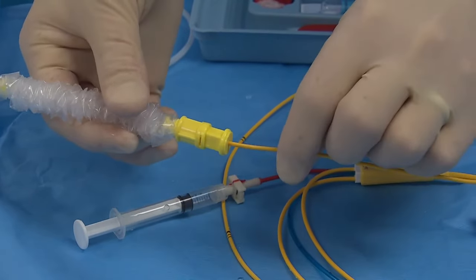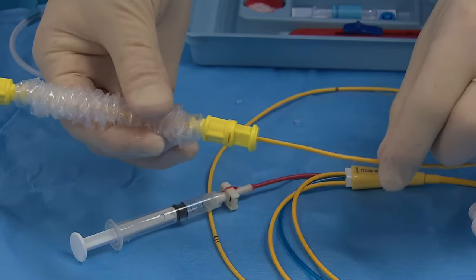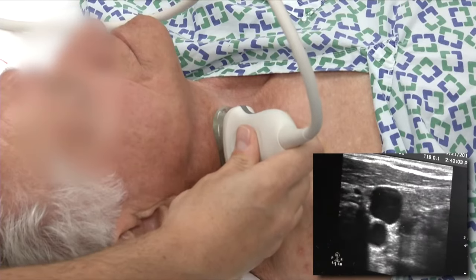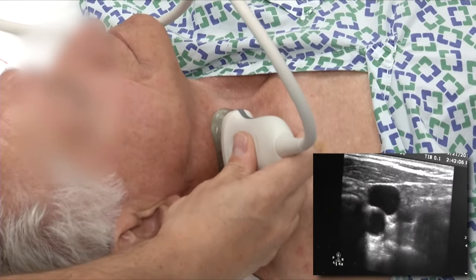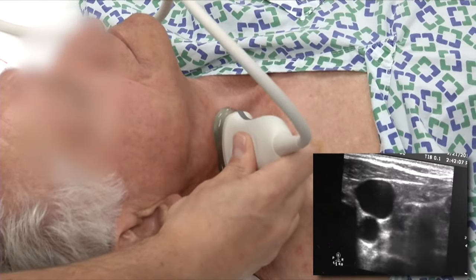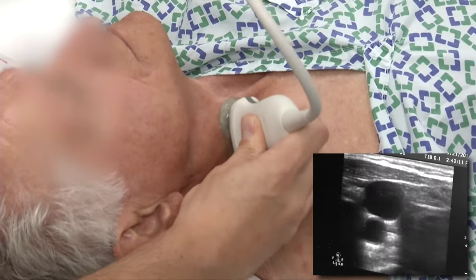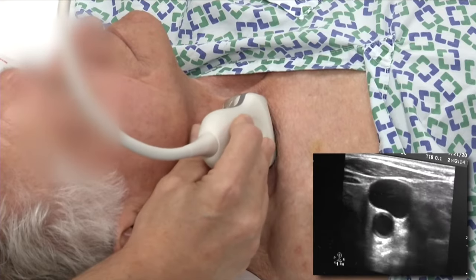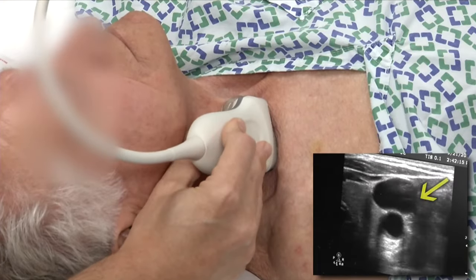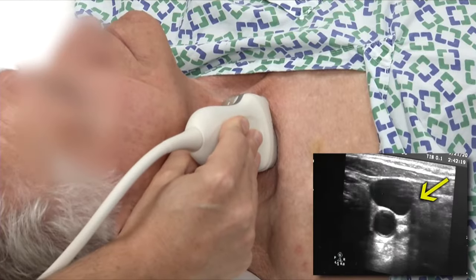This sheath allows for manipulation of the catheter at a later time without compromising its sterility. At this point, it is safe to begin the procedure. First, utilize a high-frequency vascular ultrasound probe to identify both the correct vessel for catheter insertion and to ensure that no thrombus exists within the vessel. In this procedure, the right internal jugular vein is identified.